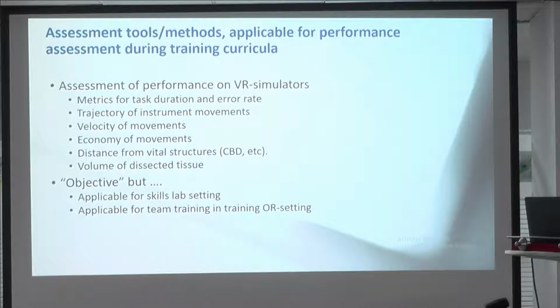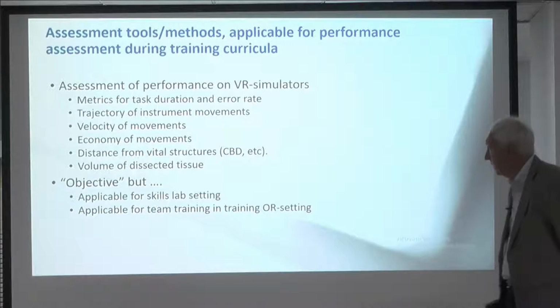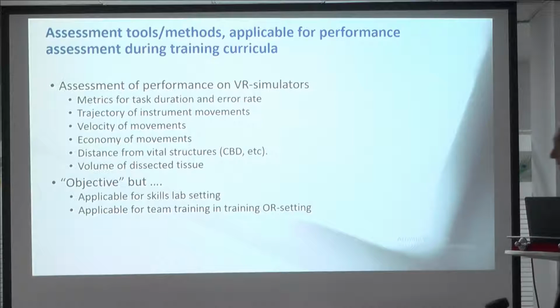The machines, the VR simulators, the augmented reality simulators, they have a capacity of measuring certain parameters, but usually we have a problem that they really measure what we see. We don't measure the image.